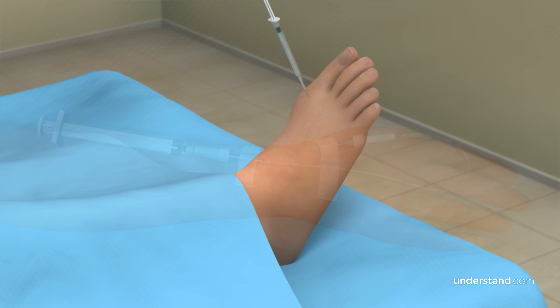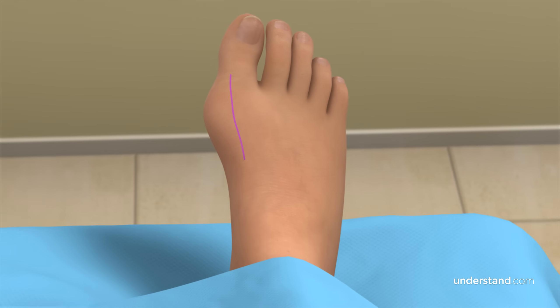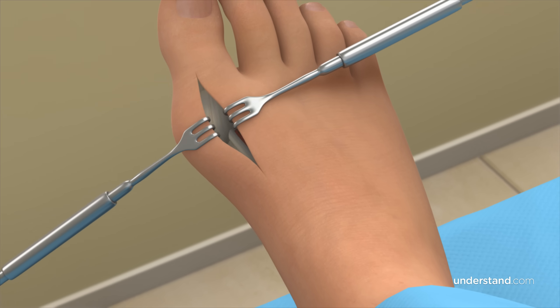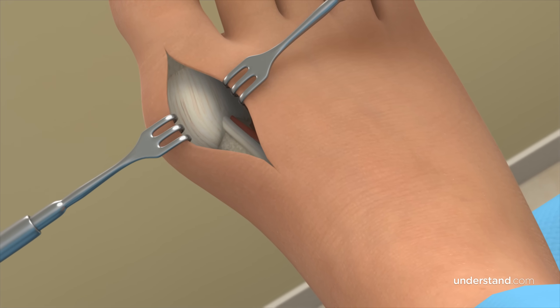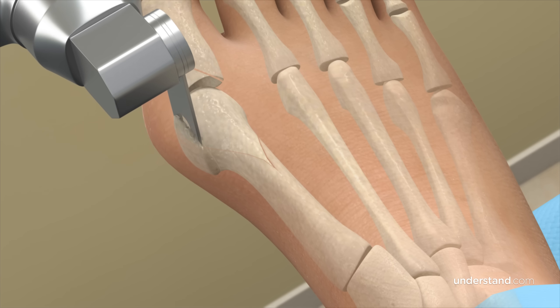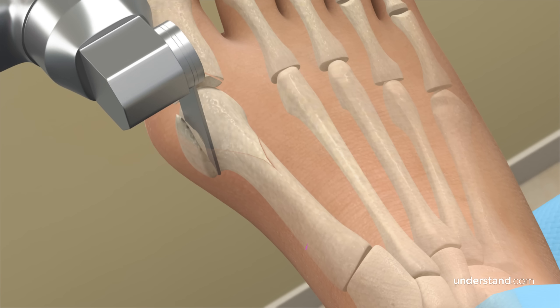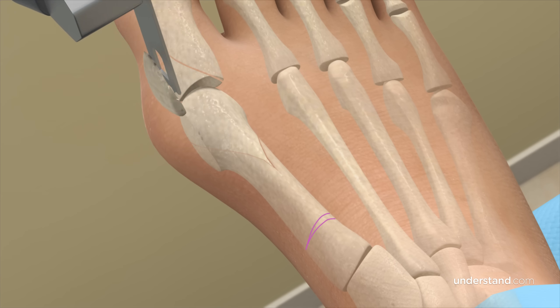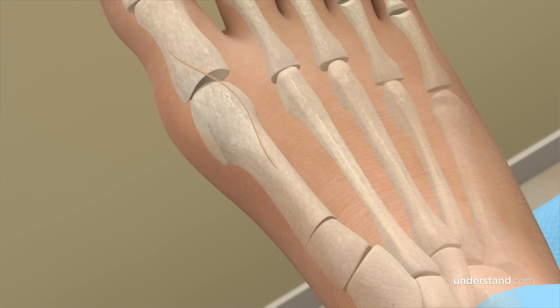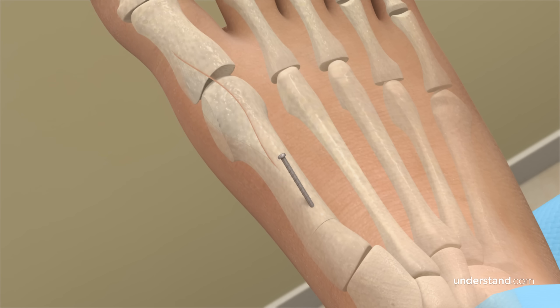In this case, your foot will be numb and you will be relaxed, but not entirely asleep. Your surgeon will make an incision on the top of your big toe or on the side of your foot to expose the MTP joint. The bump is removed first, but this will only correct the deformity temporarily if not combined with other repairs. Typically, a small wedge of bone is also removed from the first metatarsal to realign the joint. The bone is held in its new position with screws, pins, or plates.